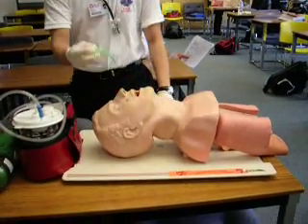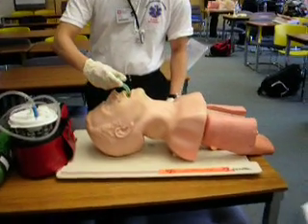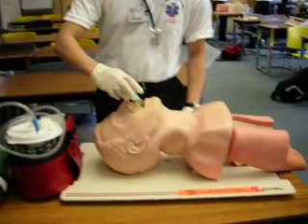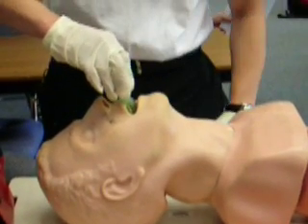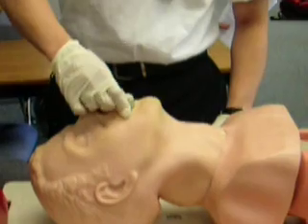Alright. From here, I want to insert it and hit the hard palate. Just put it in halfway. When I put it in and it touches the hard palate, I twist it and put it in right here.